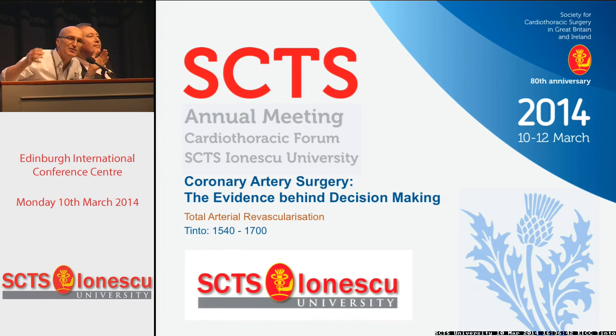You only do TTFM after you've done your graft. But I think the key point about FFR is that we definitely know, particularly for radial arteries, that they are very sensitive to competitive flow compared to the internal mammary artery, and also compared to vein grafts. Vein grafts are simply capacitance vessels, and they will often stay open even when there is competitive flow. So if you take the scenario, for example, a right coronary artery with a 60 or 70% stenosis, the only thing that's going to stay open in that situation is a vein graft.